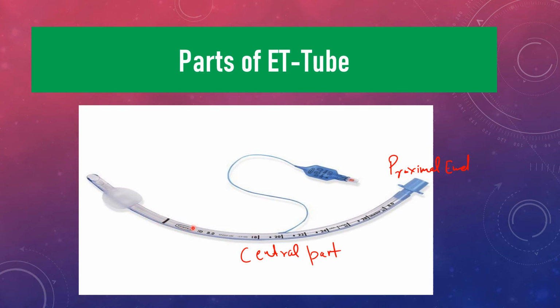And here you can see this is the ID. What is ID? So this is the internal diameter. So there are so many different sizes of ET tube, so it is measured in ID. We are going to discuss it later on.